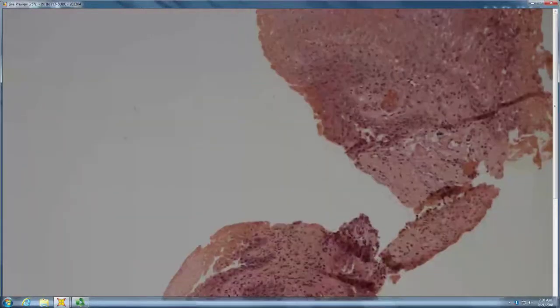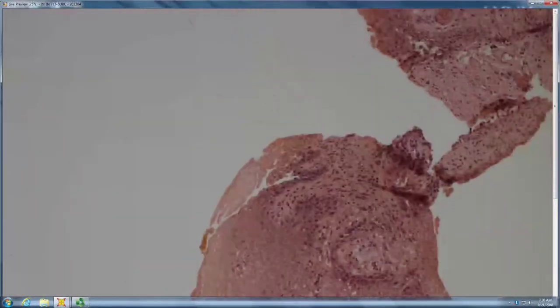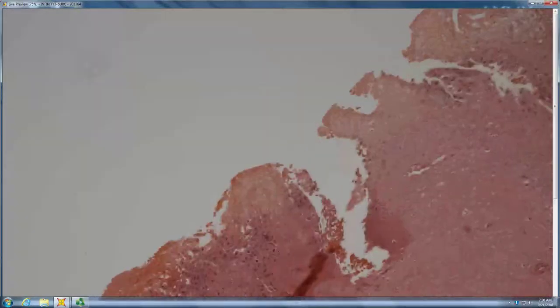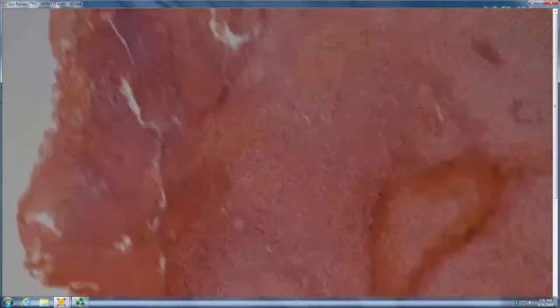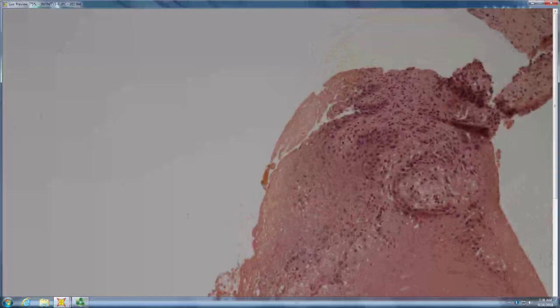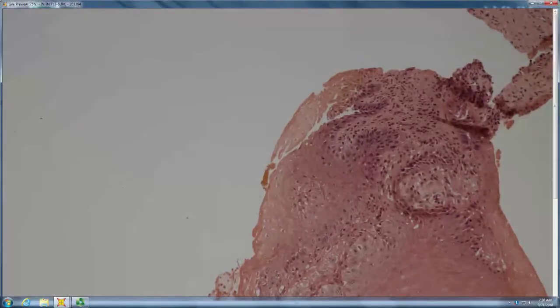I agree. It looks like it's a little bit of acantholysis right there in the corner. That's about what you get. So you might think of the possibility of pemphigus. If this is mucosal, is that more likely vulgaris or foliaceous? Vulgaris.